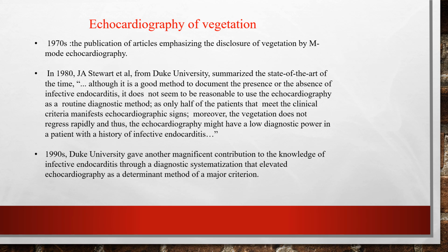"Moreover, the vegetation does not regress rapidly, and thus echocardiography might have a low diagnostic power in patients with a history of infective endocarditis." And to be fair to him, this was in the era where M-mode was mainly the main echocardiographic tool at that time.